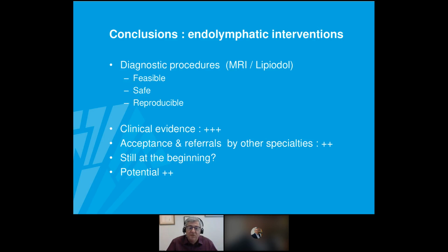But let's say they do not. You can also start immediately with your lymphangiography, even if the patient does not have these drains in place.